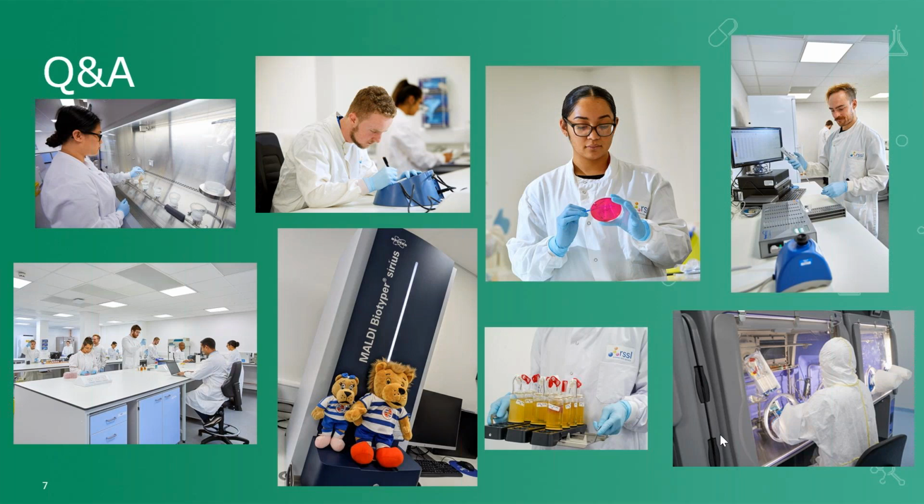Then it's possible just to look for other types of reactions like color or other forms of density, and you can either do that visually or by using optical methods as well. Or, as I was alluding to earlier, if you want to test the process and show the process doesn't consistently produce particles of concern, run a non-cell based solution through the process and then do liquid particle testing at the end of that process.